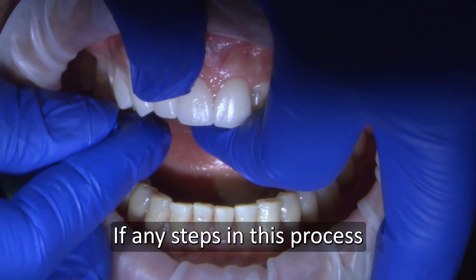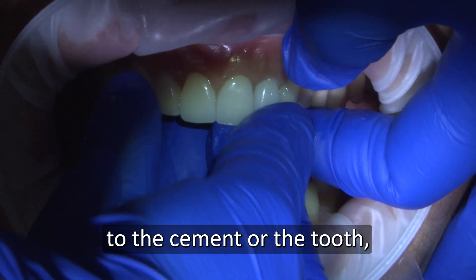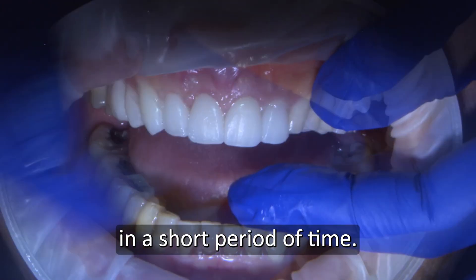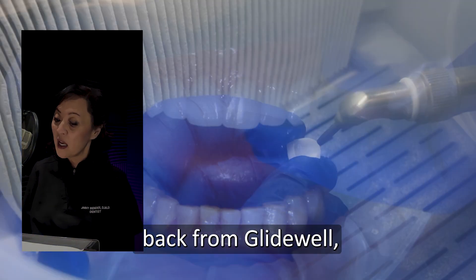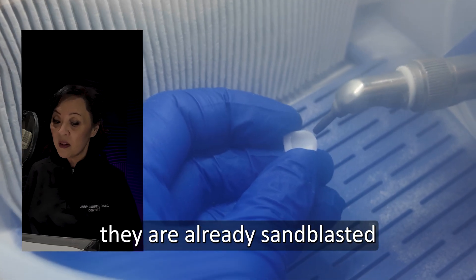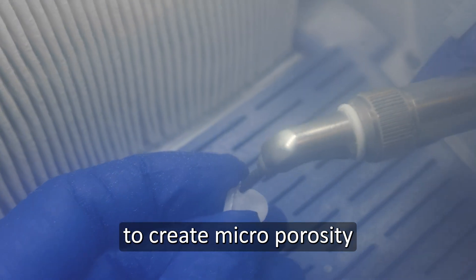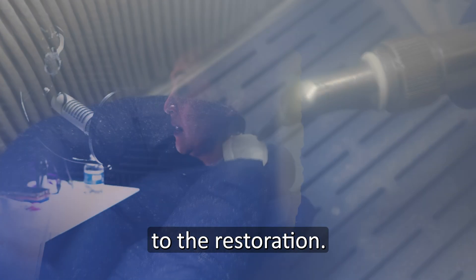If any steps in this process are not followed, the restoration will not optimally bond to the cement or the tooth, meaning your veneers will fall off in a short period of time. When you receive your Bruxer Aesthetic Veneers back from Glidewell, they are already sandblasted on the intaglio surface to create microporosities that enhance micromechanical retention of the cement to the restoration.